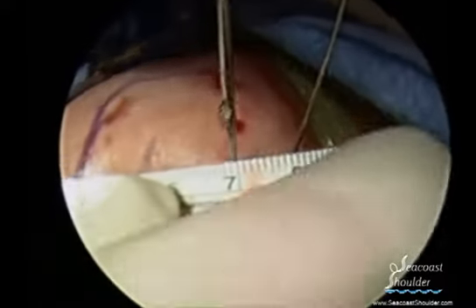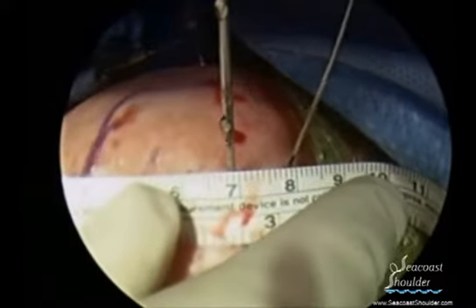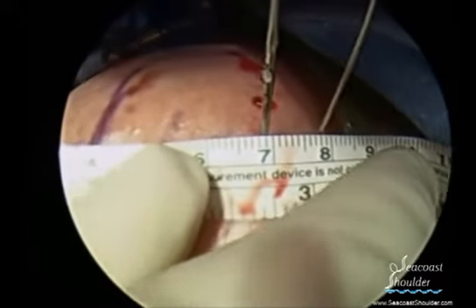The arthroscope is brought out of the acromioclavicular joint and visualizes the two needles as they penetrate the skin, showing a 10 millimeter resection, which is what we are trying to accomplish with this procedure.